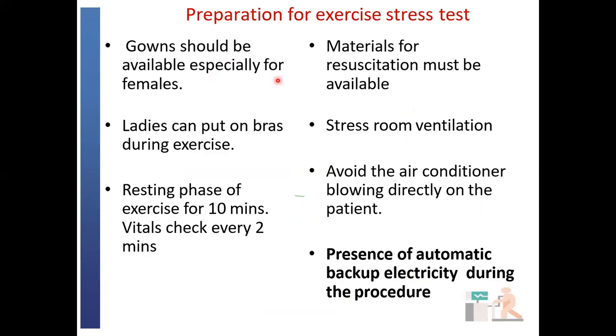So as part of the preparation, patients should be gowned, especially females. Ladies can be allowed to put on their bras during exercise. For the resting phase of exercise, for 10 minutes, you do a vital check every 2 minutes. Materials for resuscitation are very important at all times, and they must be functional while conducting a stress test, because even though the rates of complications are very, very low, and when you get your patient selection and screening very well, these complications are unlikely to arise, you can never say never. Some of those complications can occur and it can be fatal.